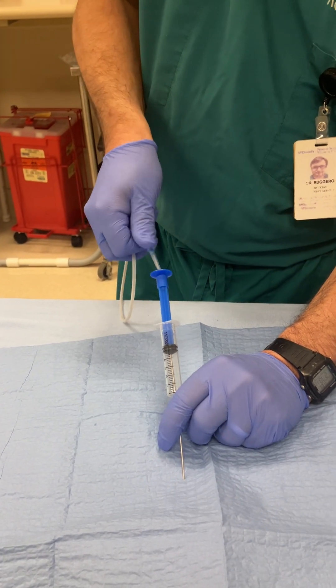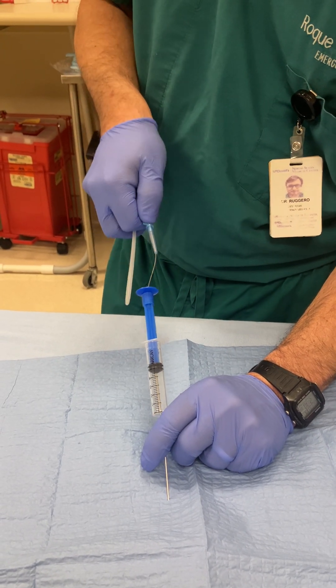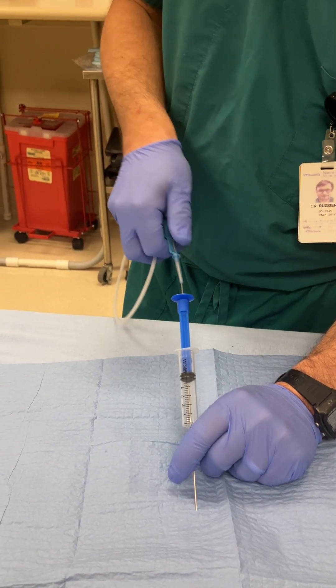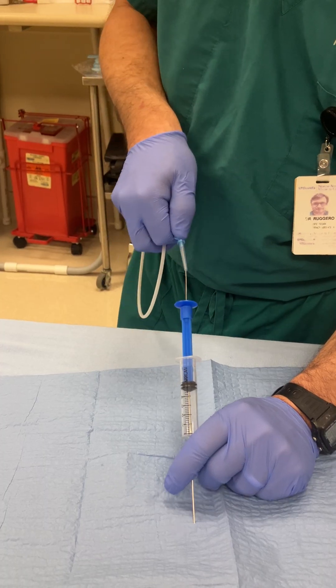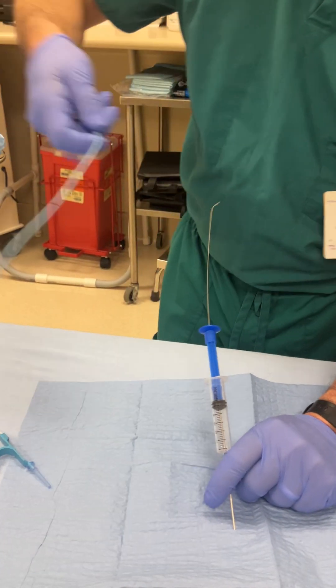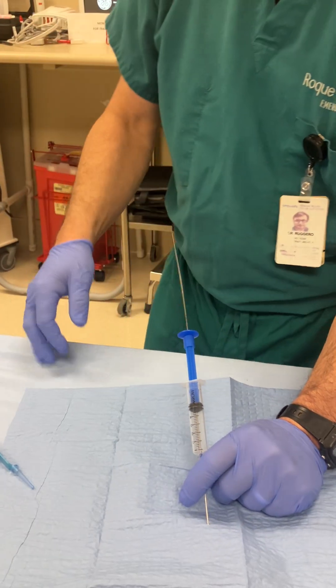I'm holding this like a trigger and advancing the wire. If I meet any resistance, I do not push forcefully. I continue to advance the wire — I don't have to advance it all the way. The vein is only a few centimeters in, and I need to have a significant amount of wire still outside the patient's body to thread the catheter through.